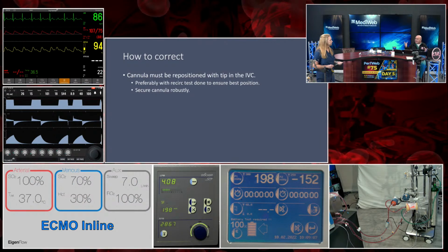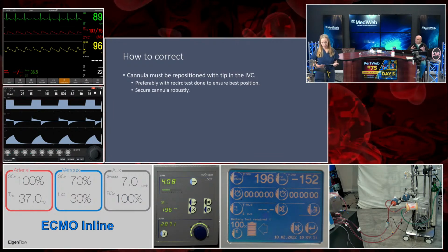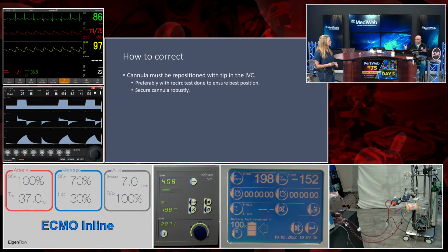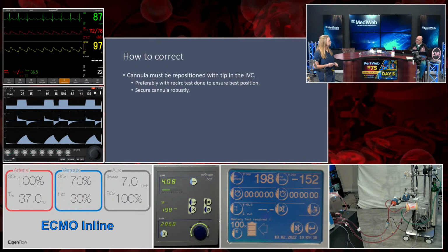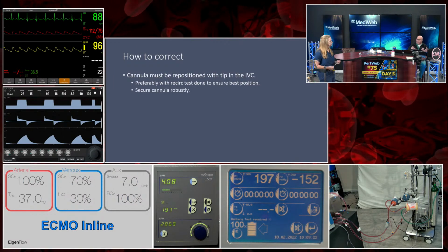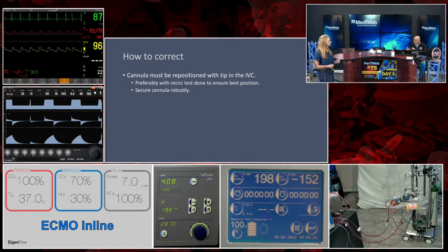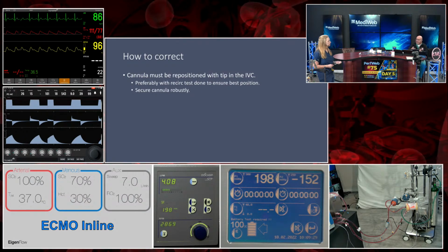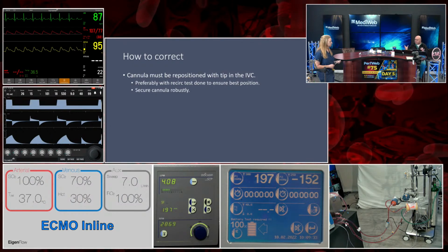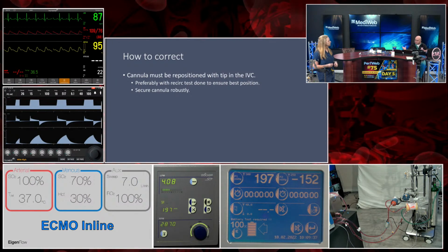So if it's very high, 88%, clearly you have a problem. But you can have 22, 24%, 25% recirculation and not have a significant increase in your SVO2, and without having a recirculation with a patient who is modestly hyperdynamic, you may have borderline to unacceptable arterial saturations that you have to take into consideration.